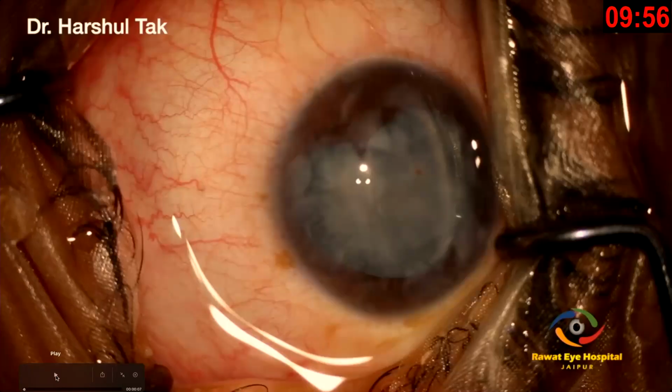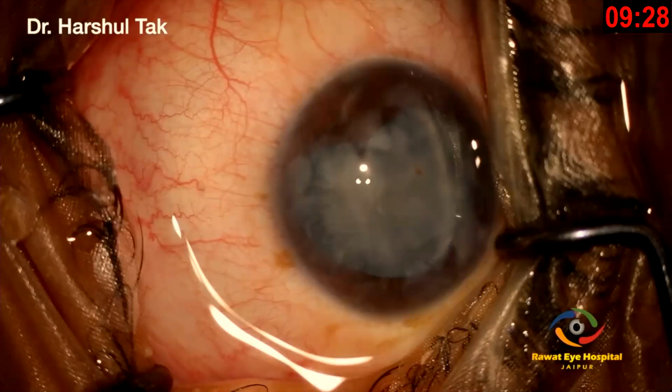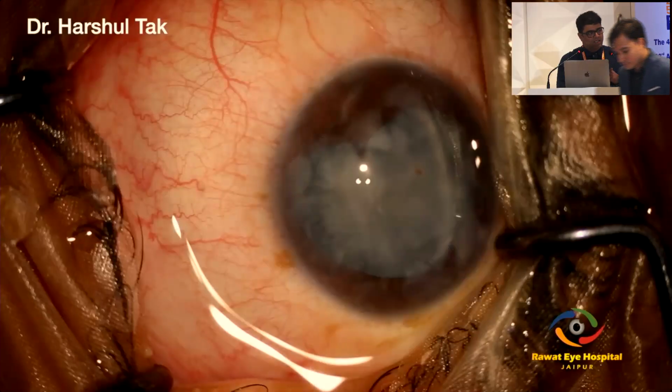So I'll be taking you through 3 or 4 traumatic cataract cases, different scenarios. We all know that penetrating or blunt ocular trauma can lead to traumatic cataracts, and it can present in varied forms. This is a young female, 28 years old, who had a thorn injury. You can see here on the cornea there is a penetrating injury, and within 2 days she developed the cataract like this. Whenever the anterior capsule gets ruptured, the cataract forms very fast, so we need to take care of it.